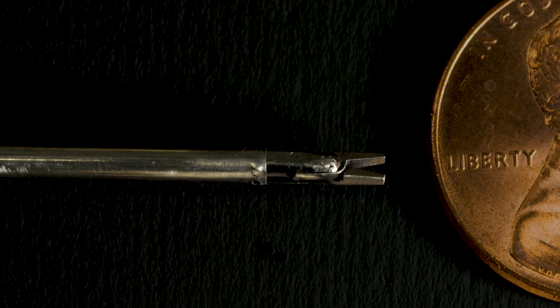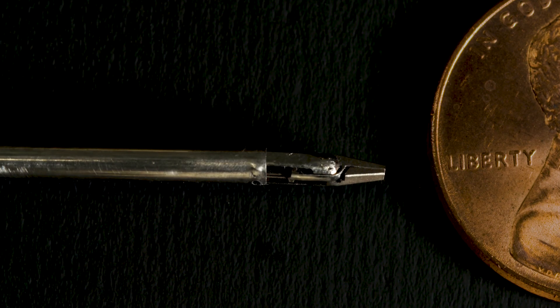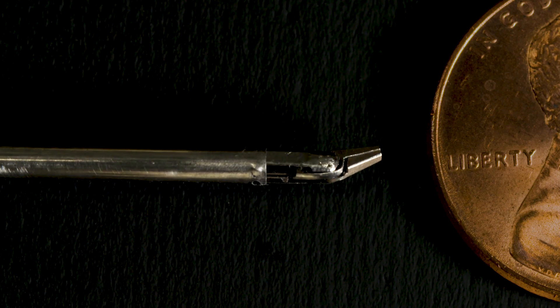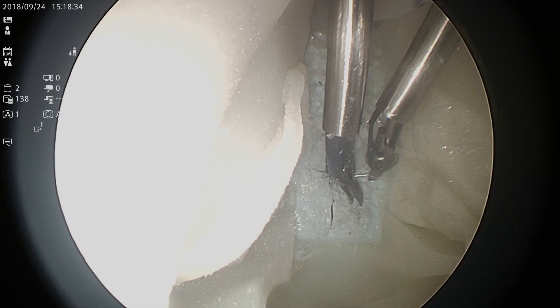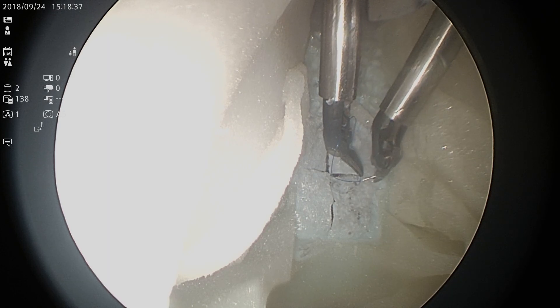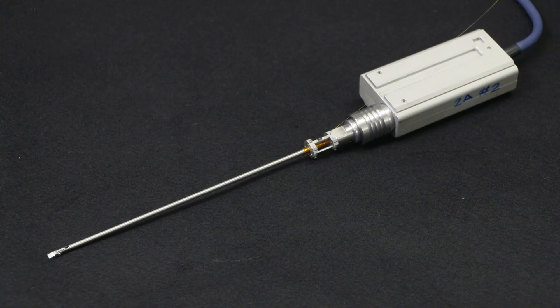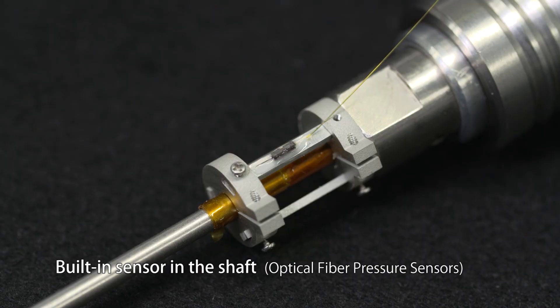The smart tool is less than 3.5 millimeters in diameter and its tip can bend dexterously. The performance of the bionic brain was evaluated using the dura mater model placed in the bionic brain. The shaft of the smart tools has a built-in sensor.